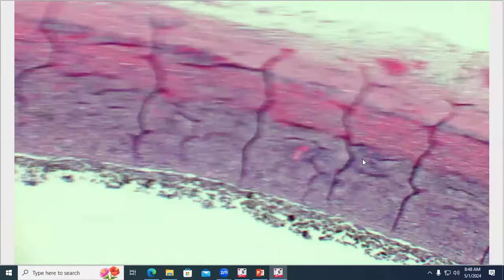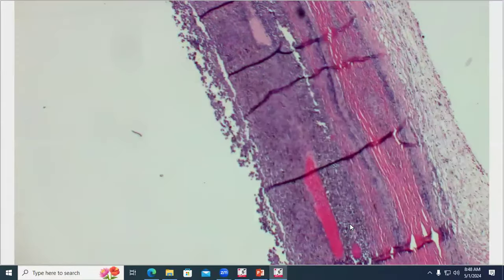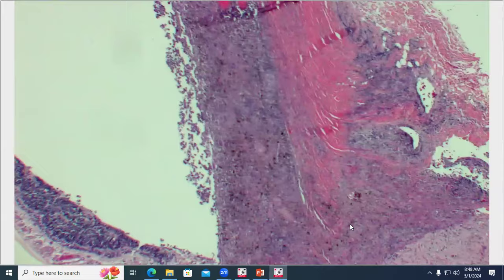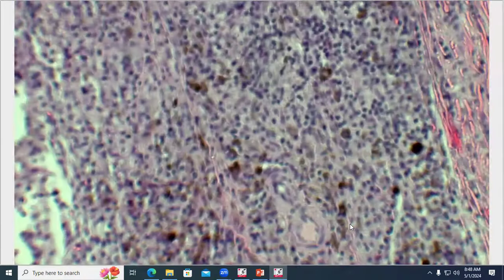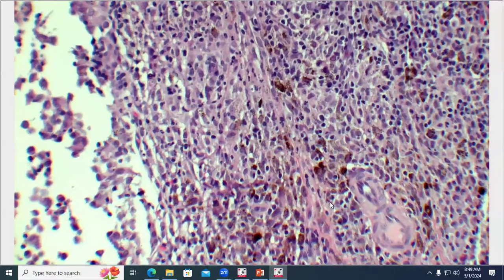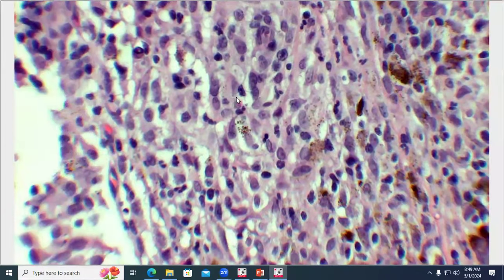And now we're moving towards the choroid. Lots of pigment in the subretinal space. Markedly thickened choroid. Let's do the same exercise. Let's go closer to the optic nerve. So we're getting closer to the optic nerve. Here's central choroid. Another beautiful example of a histiocytic, lymphoplasmacytic, inflammatory infiltrate with lots of melanin-laden macrophages throughout, right? So it's a pattern.